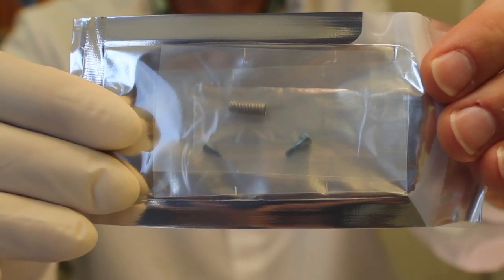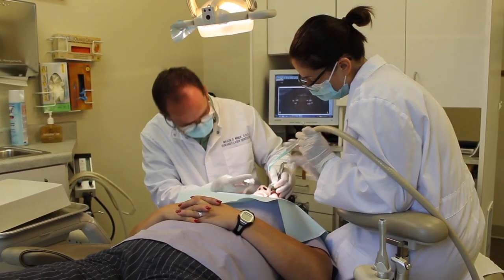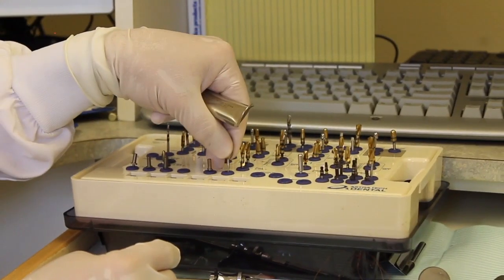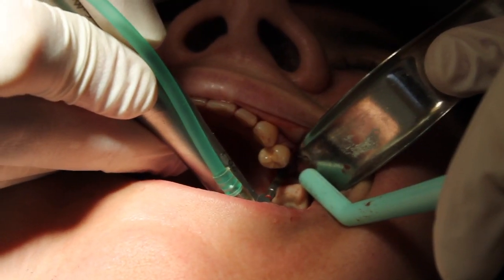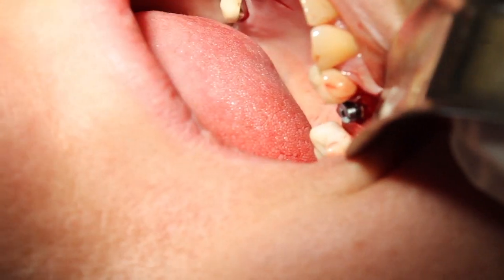I'm Dr. Mason Miner, and we're here today with Layla. We're going to surgically place two implants, one on each side on the upper jaw. Part of the process — what we do is make an incision to uncover the area, then essentially make a hole in that and screw in the implant and let that heal.